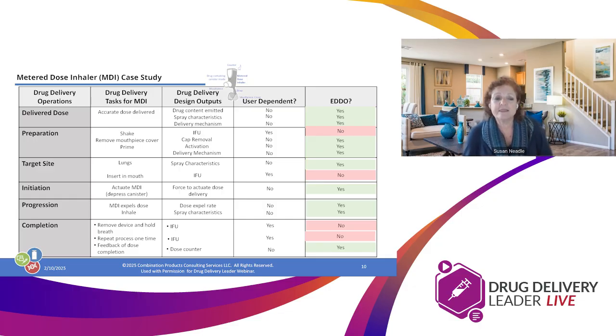What about the initiation step? I need to actuate my dose, right? I'm going to depress my canister. And when I'm depressing my canister, the force that's applied to actually actuate that dose delivery is my drug delivery output. It is not user dependent. And yes, it is an EDDO.